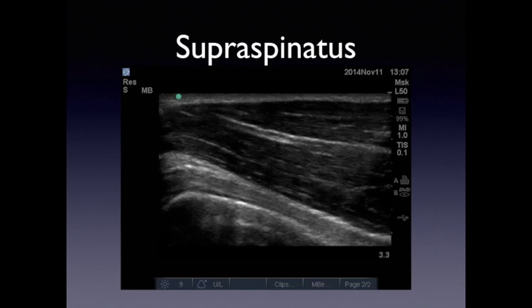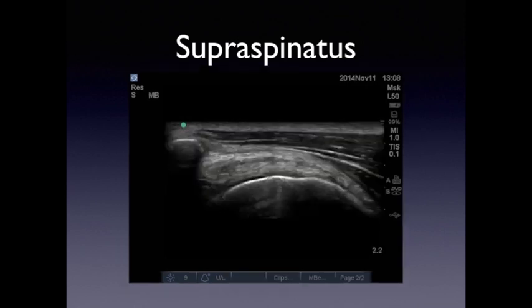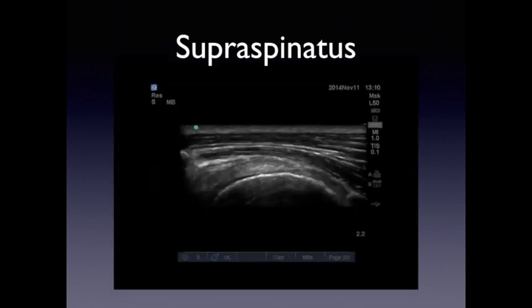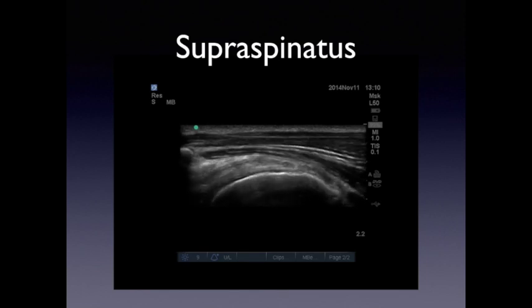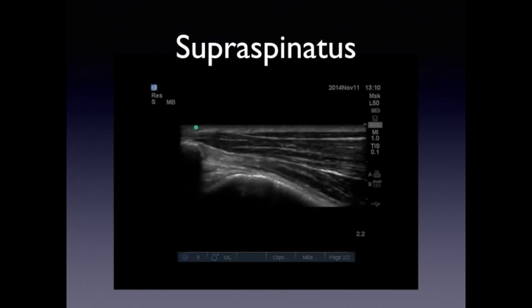You will obviously see fibers from the deltoid, and as you move along you'll see the acromion along with the hyperechoic humeral head, and then you'll have the supraspinatus muscle. As your patient starts to abduct the arm, you'll see the movement as the supraspinatus glides under the acromion and then disappears.